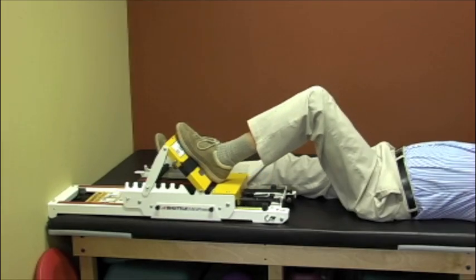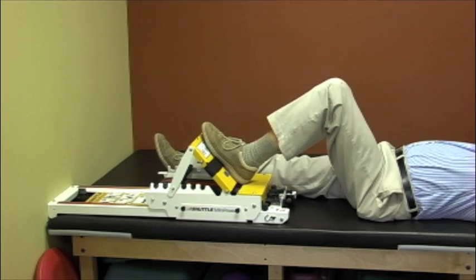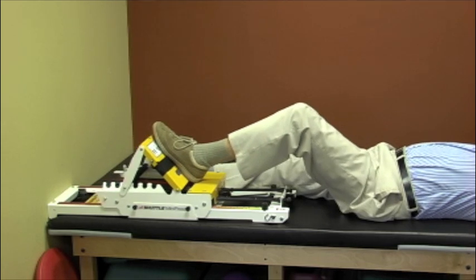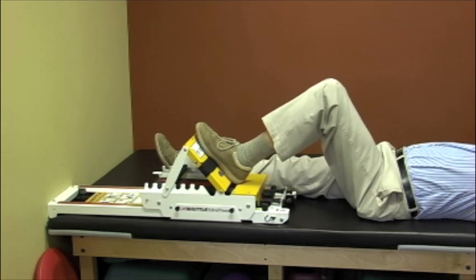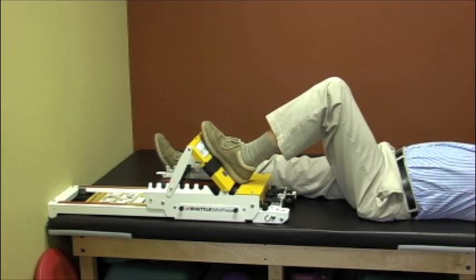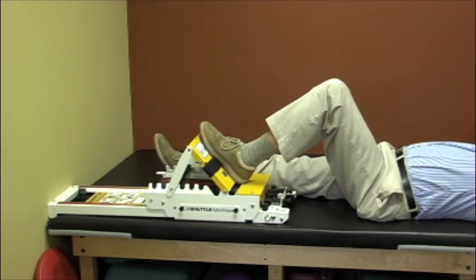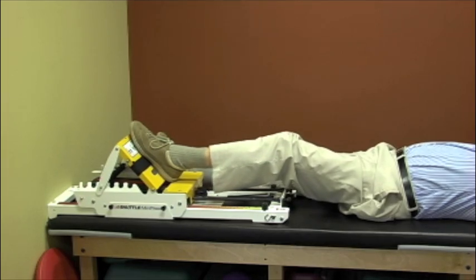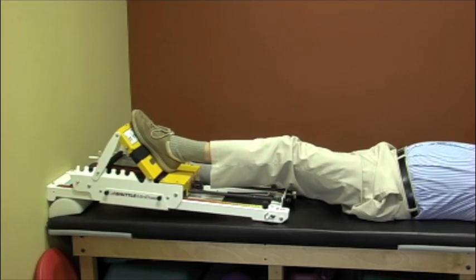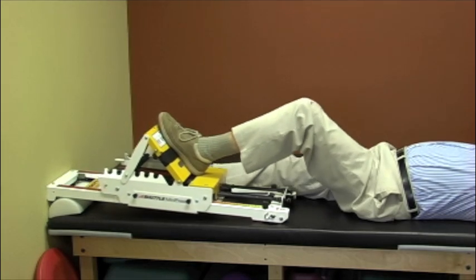Now we've moved the Mini Press onto a table platform or a plinth platform — this could also easily be a client's bed and we can work on leg presses from the bed. One feature to consider is giving a stable base to push from, so having it against the wall or the foot of the bed would be helpful. Also make sure the track has clearance underneath, not catching any linens — you can support the end piece up a little bit to give you some clearance.